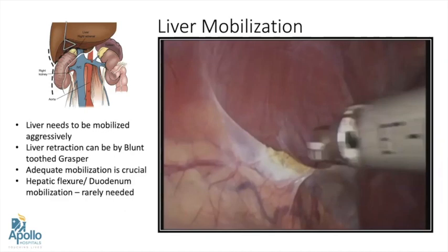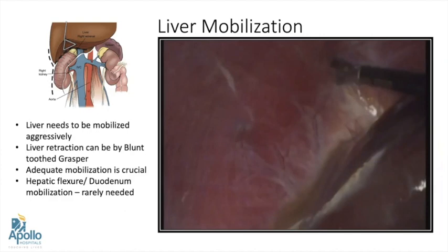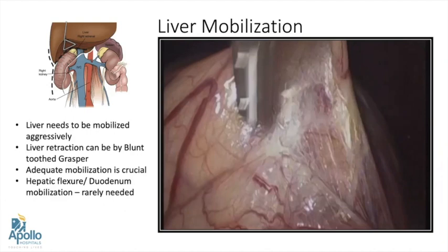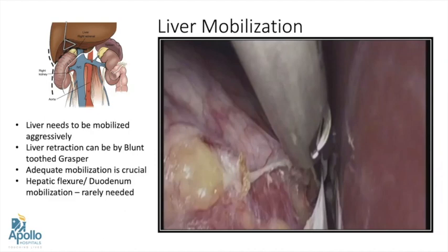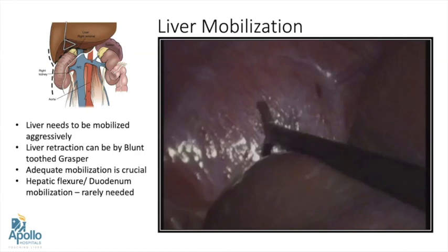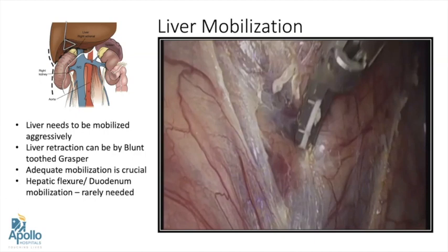The first step after inserting the port is liver mobilization and we need to mobilize the liver aggressively. All the triangular attachments on the liver should be taken care of. The liver can be retracted with the help of a blunt grasper. The peritoneum over the mass is opened at the junction between the mass, kidney, and the IVC — a triangular junction. All the peritoneum over the mass should be excised using an electrosurgical instrument up to the lateral border.